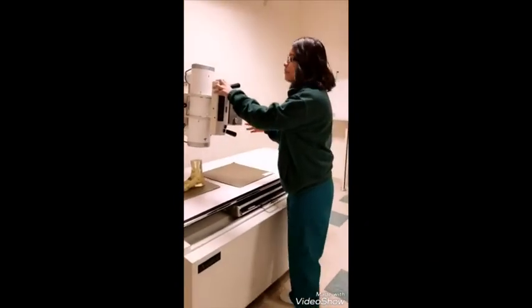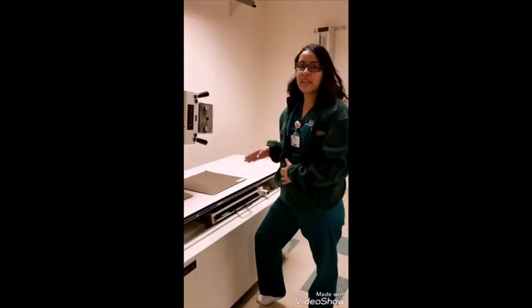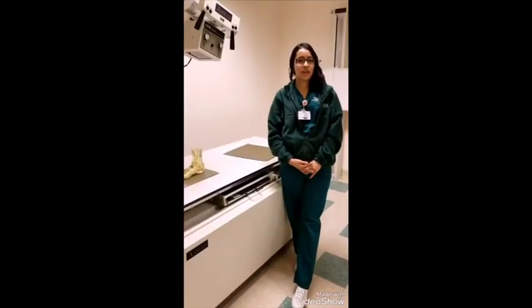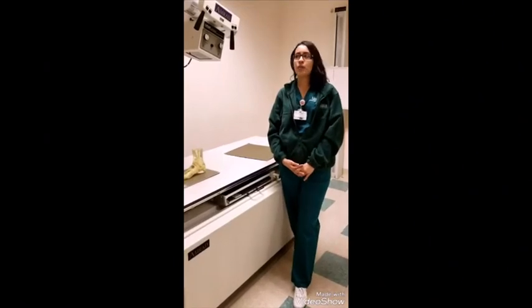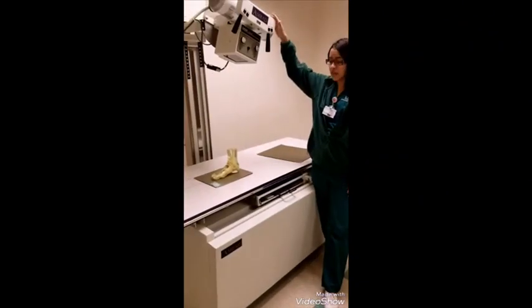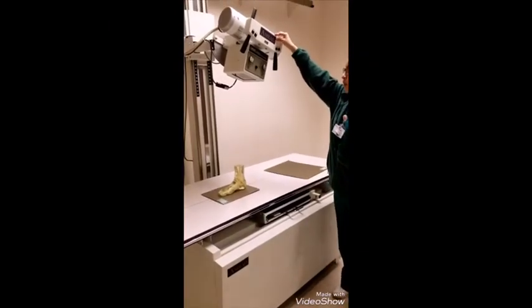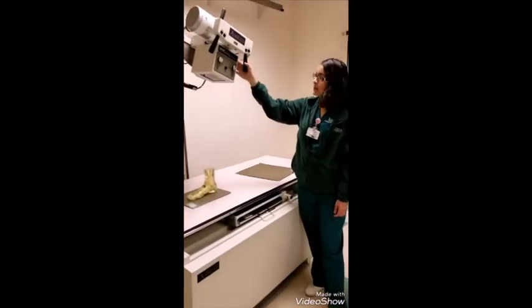This one, for example, is called off focus. It means that there is more SID than there should be. Another type of grid error is called off level. Off level is when you have an angle in the X-ray tube or in the IR. In this case, we have an angle in the X-ray tube. So this is how it would look.